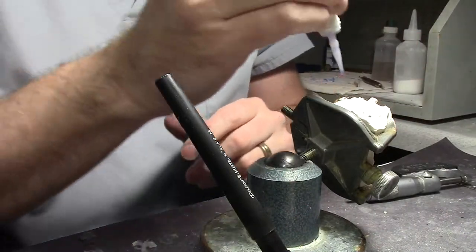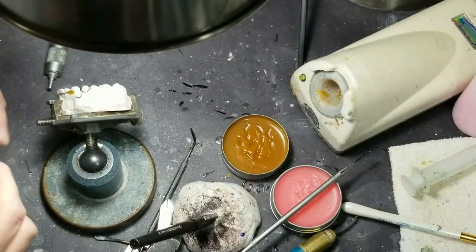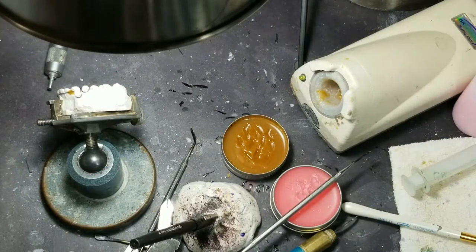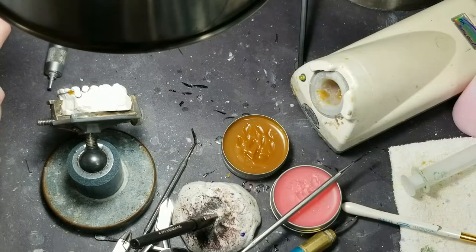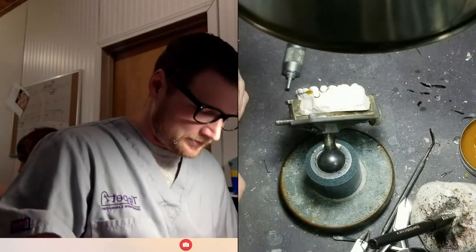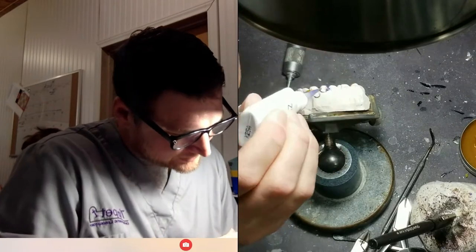I couldn't do this method with just wax — the wax would melt when you're trying to solder it. So I use this stuff to hold the wires on. And if y'all didn't know, I made a New Year's resolution at the beginning of this year — I was going to do a live stream every week for a year just to see how it goes, and also get my money's worth out of this system I got.